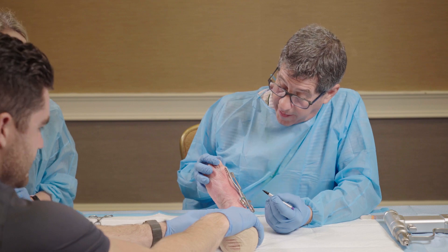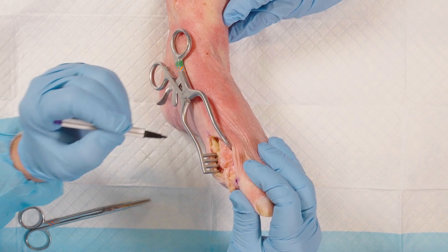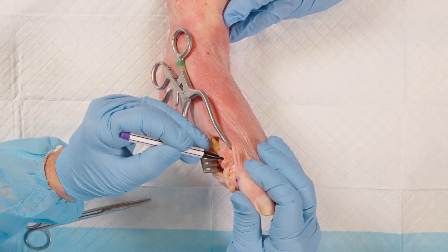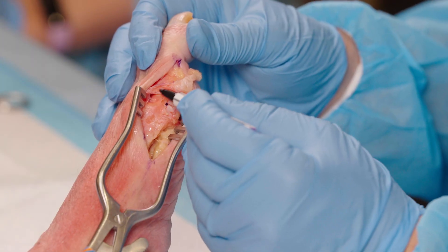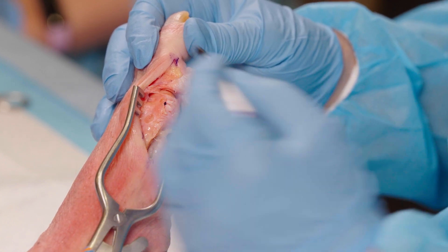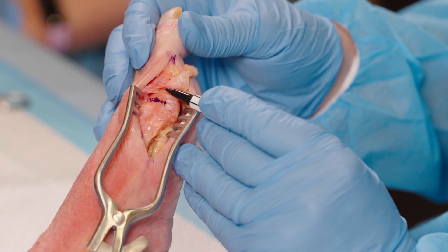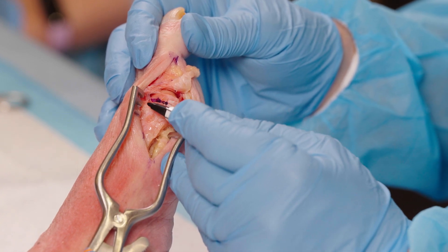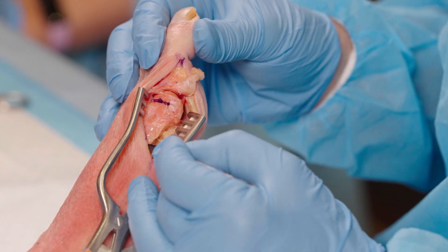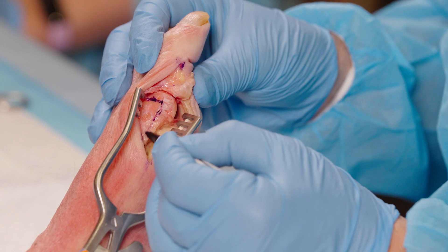When I go to make my osteotomy, I look at the head of the metatarsal and I think to myself there needs to be a coin on the head of the metatarsal — that makes sure I place my osteotomy apex properly. I'm going to be making the distal aspect of my osteotomy in the cancellous head of the metatarsal, about the dorsal two-thirds, and that's where one apex is going to be. Then I'll make my dorsal osteotomy about a half a centimeter or a centimeter behind the metatarsal head. My proximal osteotomy is going to be back in the plantar one-third and I'm going to connect those two areas.